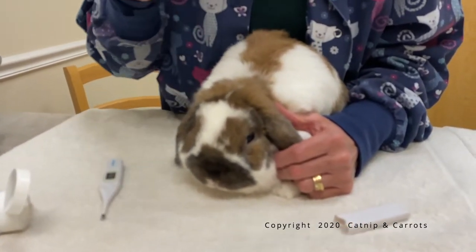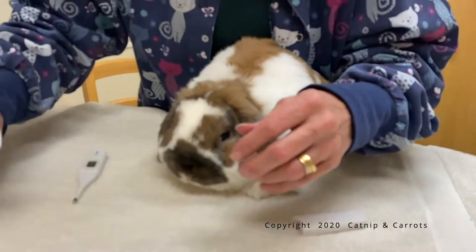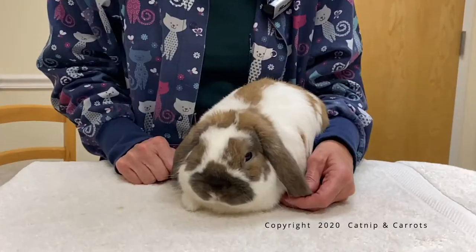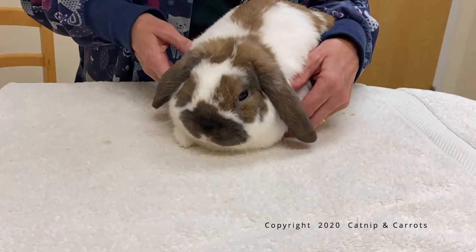If they lick dishwashing liquid, it's not going to kill them. So here we're going to put some lube on the thermometer right here. Now we're going to demonstrate temperature taking.